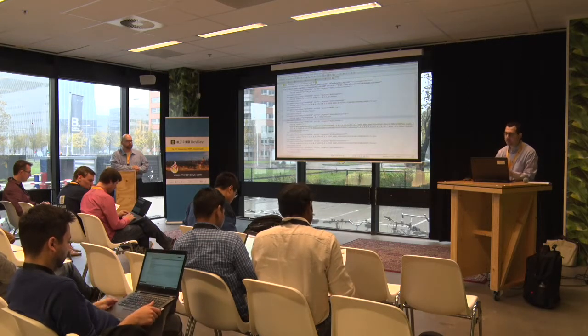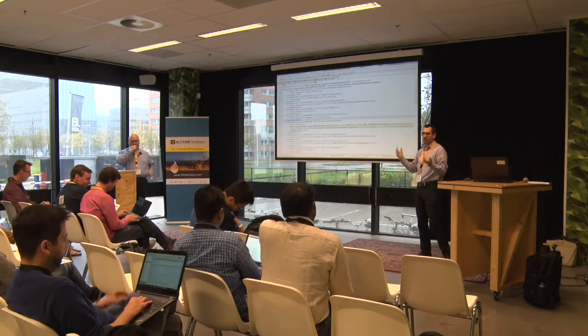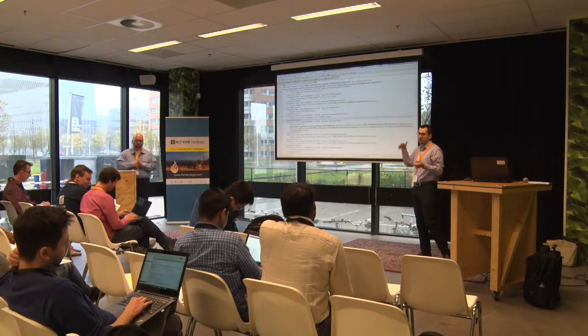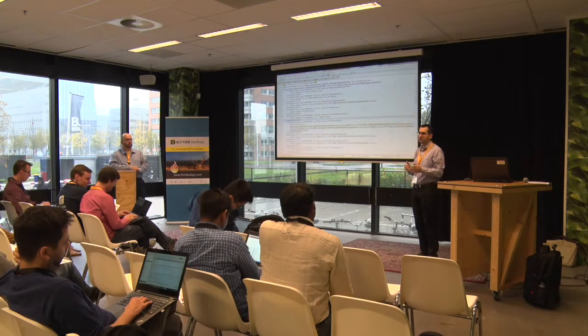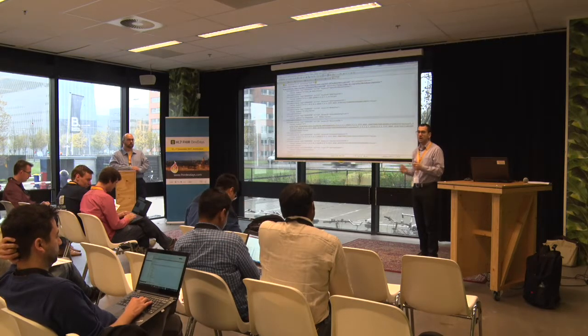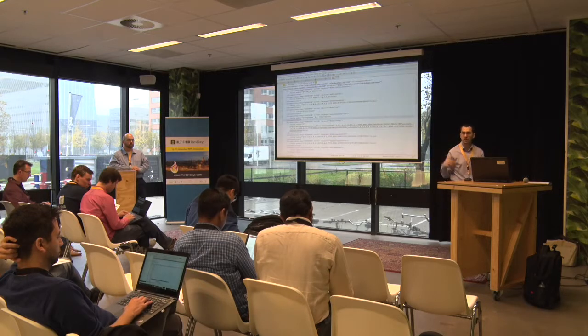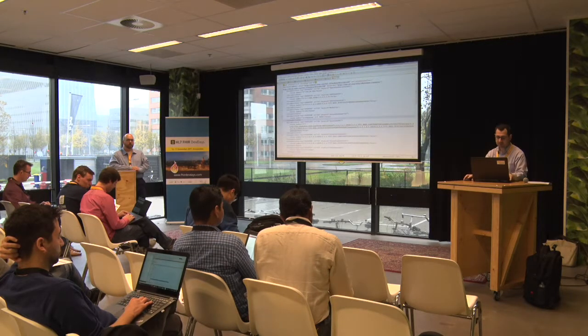Correct. Basically what happens is the server will typically return a default set of parameters, and these defaults are not guaranteed. One server may choose to return the patient's sex, for example. Another server may not unless you explicitly ask for it. So it's a way of specifying what you want back. If you need more information back, you have to tell it in advance. You can't assume you'll get that.